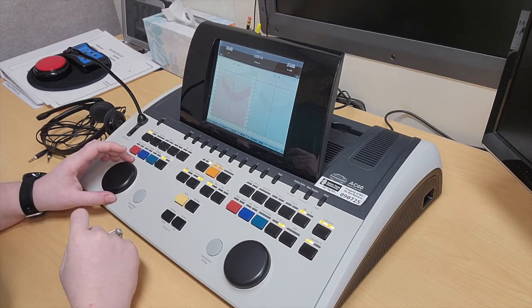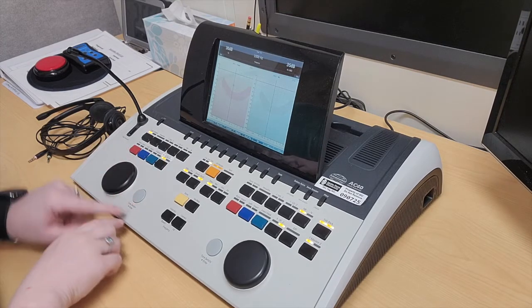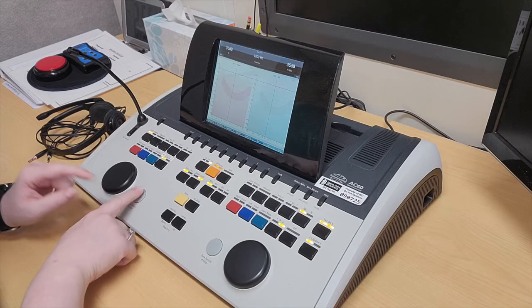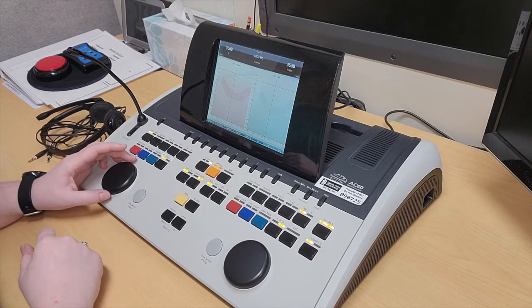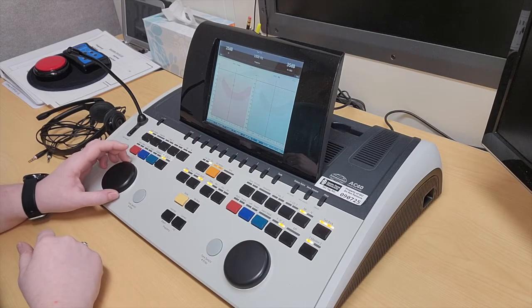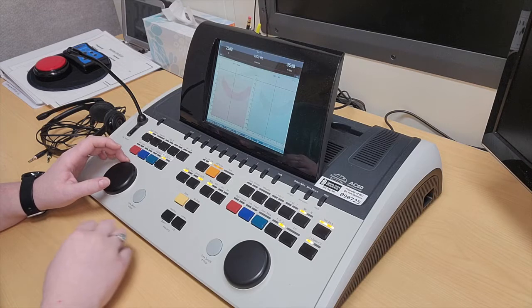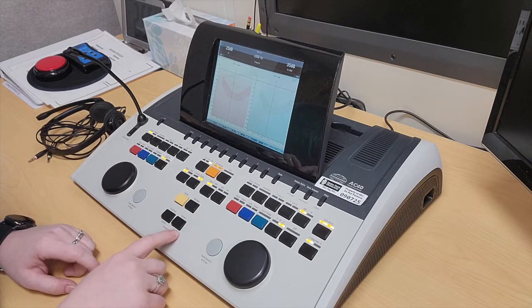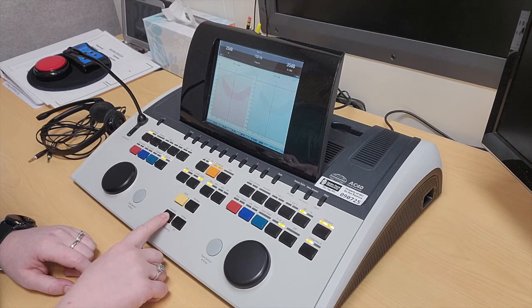In order to present a stimulus, you would click this button here. You can go up or down to change the intensity, and then these buttons here allow you to change the frequency.